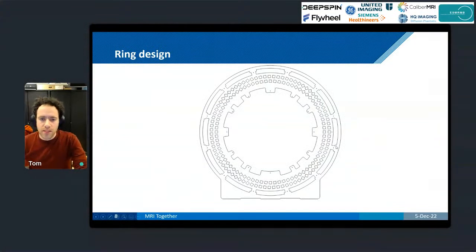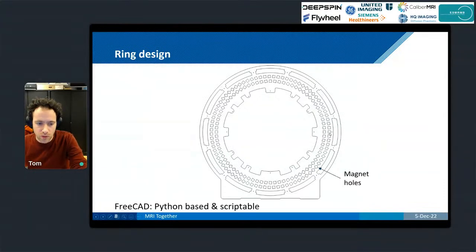So you have your optimization, or the results from your optimization, and now you have to go about actually designing your own open source magnet. There's a lot of magnets to draw. There's about 4,000 of them.